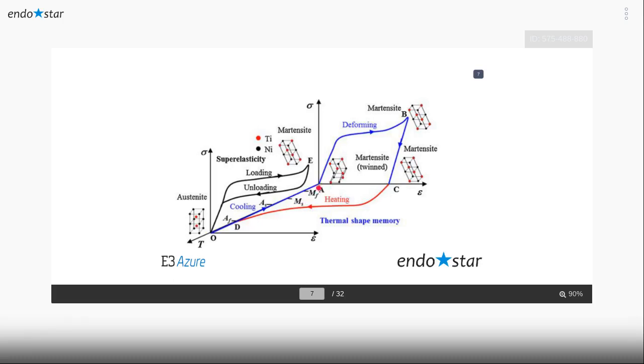But if we start from this point, which is the martensitic point, the file can undergo deformation within the elastic region until it reaches here, the point of plastic deformation. But in austenitic, you have one point and then you go to plastic deformation, which means file fracture. That's why martensitic files have been produced, not only to pre-curve the file for inaccessible areas so you can insert it inside the canal, but also to take more maneuvers, more curves inside the canal.